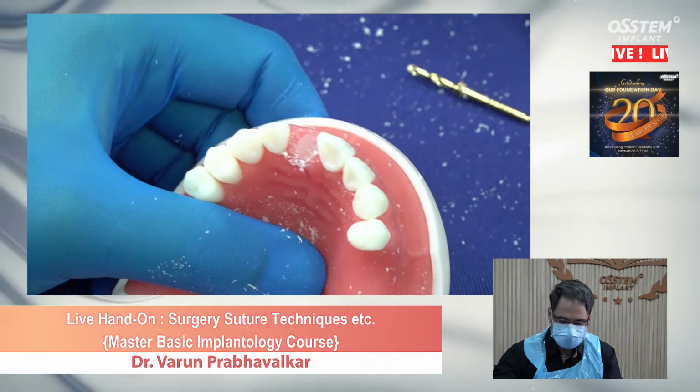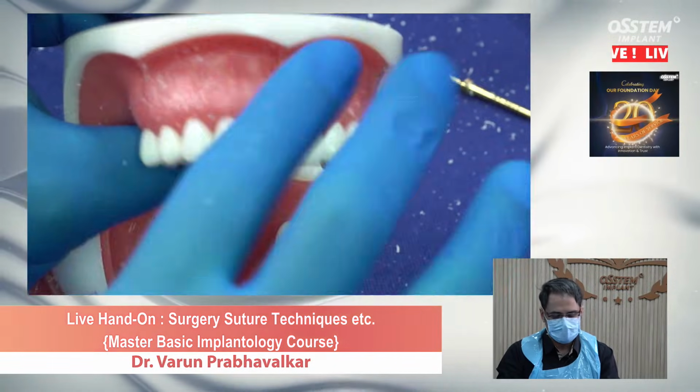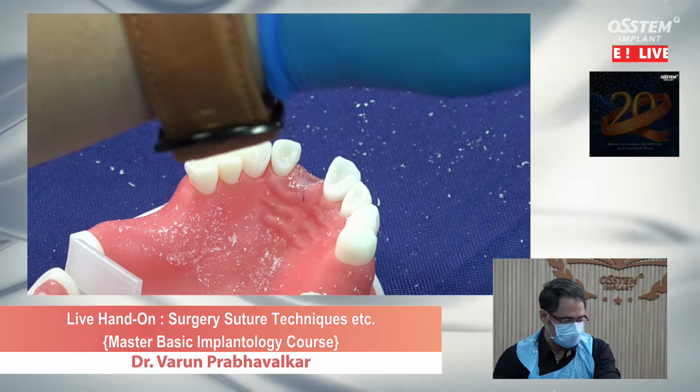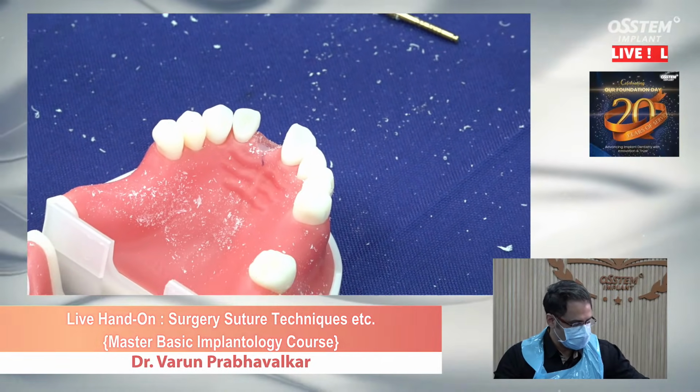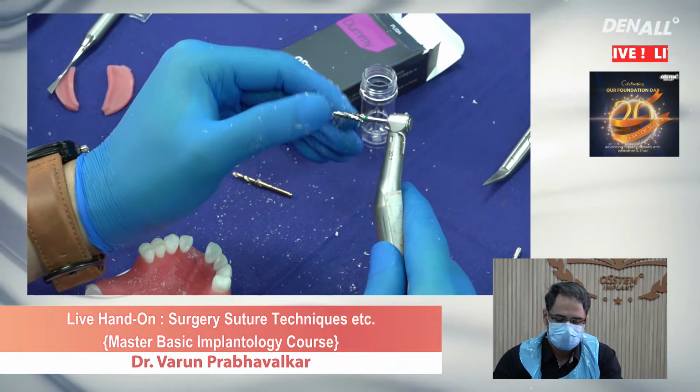Okay, too much of mess with the styrofoam model. Our next drill is a final drill of 4 by 13 millimeter.